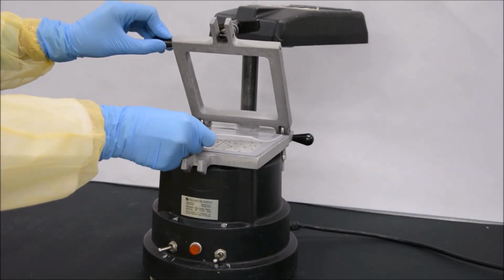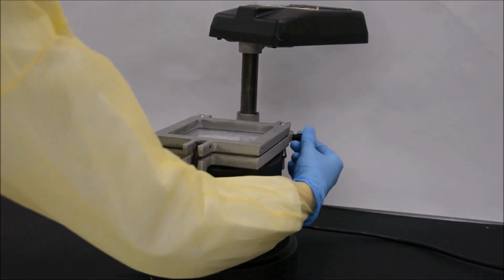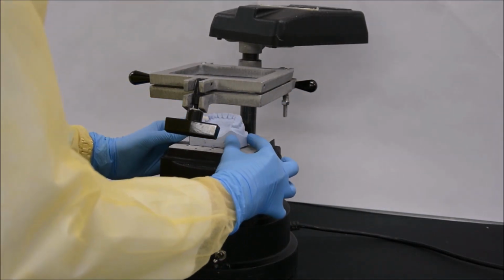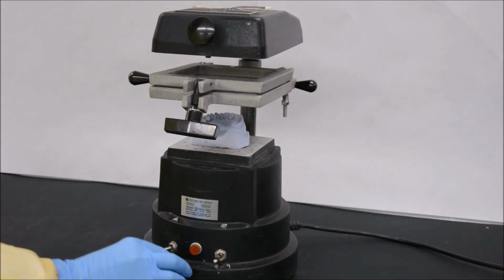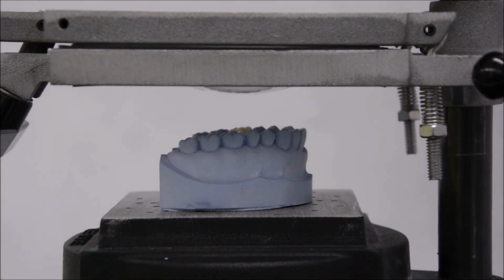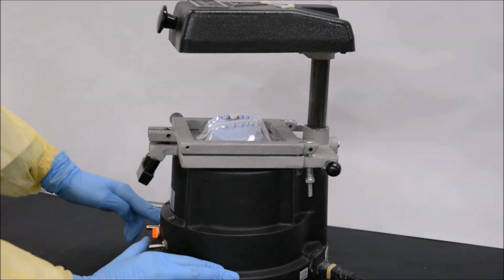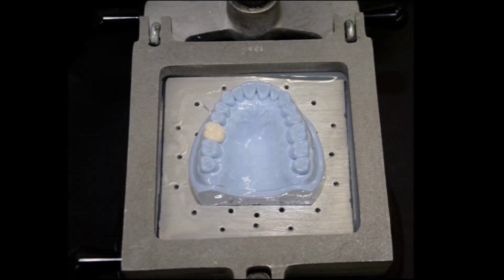For the purpose of this video, the external surface form will be fabricated using a thermoplastic mold. The thermoplastic sheet is placed in the frame of the vacuum press machine. The cast is aligned to be in the center, and the sheet is then heated till it sags. The heated sheet is then lowered and the air suction is turned on to enable adaptation of the sheet on the cast.